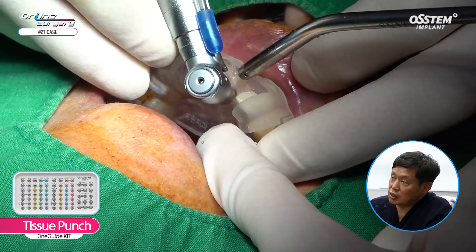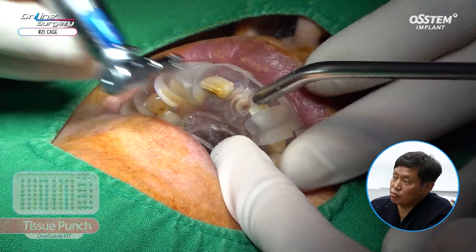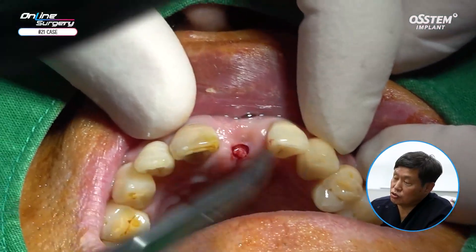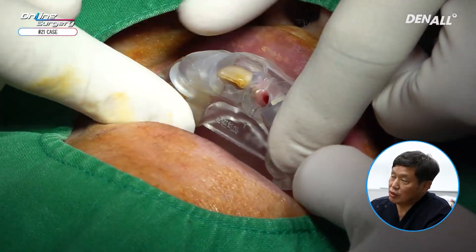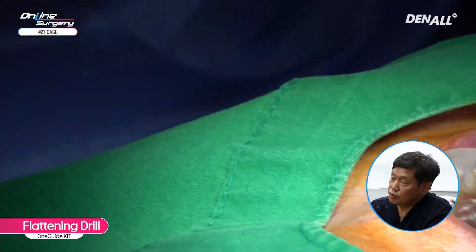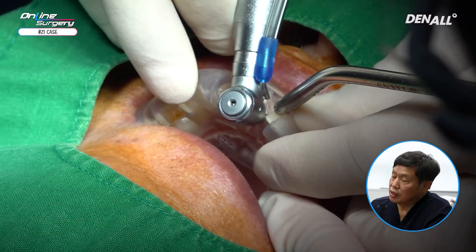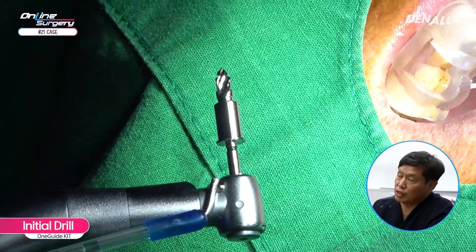While creating the OneGuide, we also prepared a provisional restoration, considering the possibility of placing it on the day of surgery. Next, we removed the soft tissue. As you can see, the implant position was placed slightly towards the palatal side. After removing the soft tissue, we used a flattening drill to trim the remaining bone. Since there was originally little to no labial bone, we proceeded with the initial drilling as per routine.